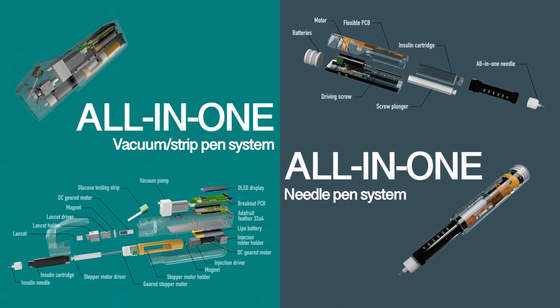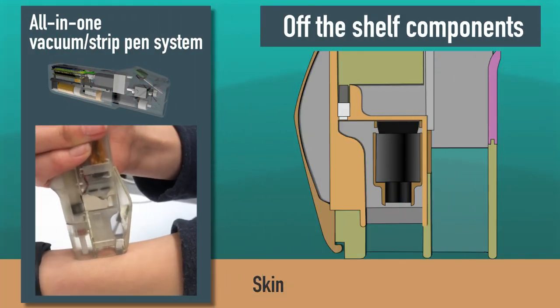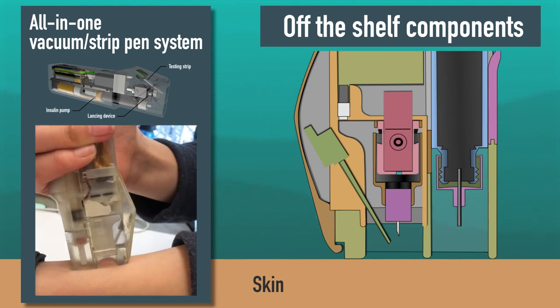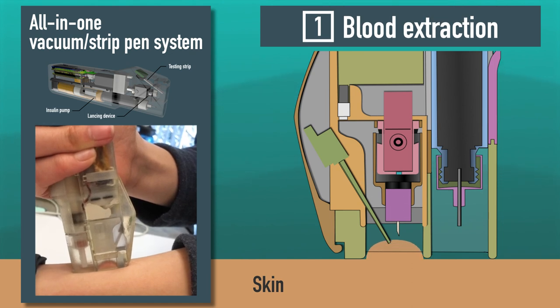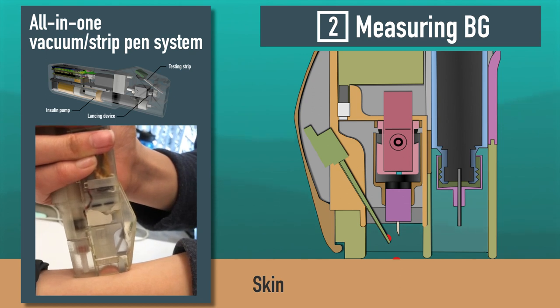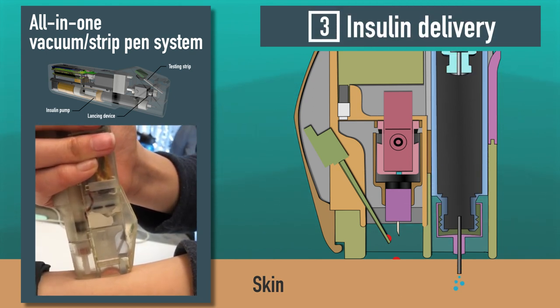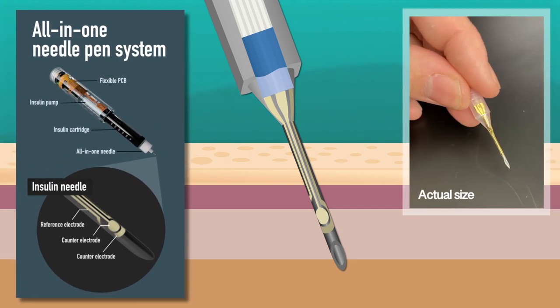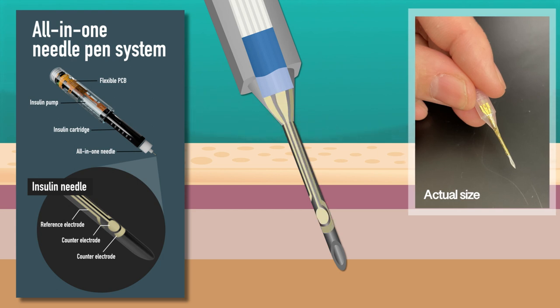To facilitate glucose measurement and insulin dosing, we developed two different types of all-in-one pens. The first system incorporates off-the-shelf components familiar to patients with diabetes into one device. This pen seamlessly integrates the lancing device and test strip for glucose measurement, as well as the insulin delivery needle, into a custom-designed vacuum-based insulin pen. The second system further simplifies by using an all-in-one system which integrates both glucose sensing and insulin injection into a single needle.